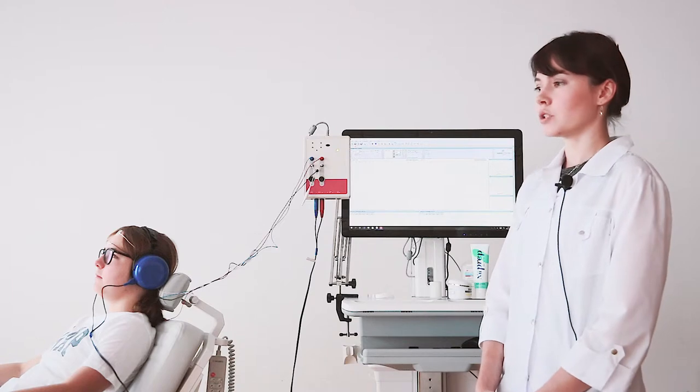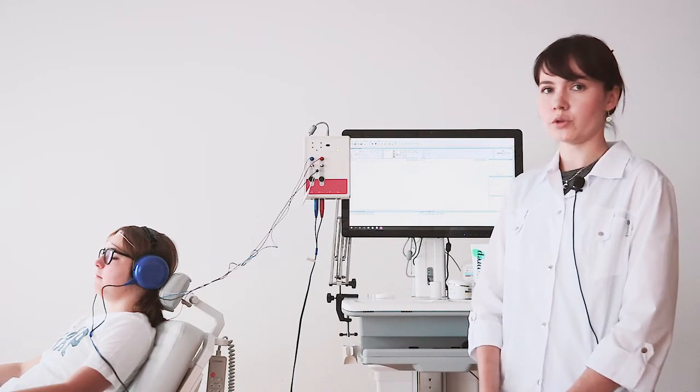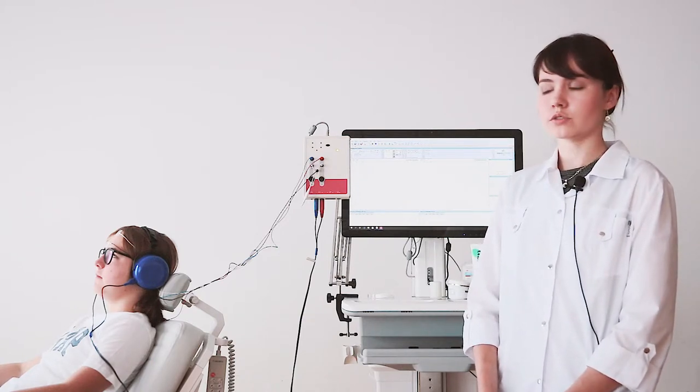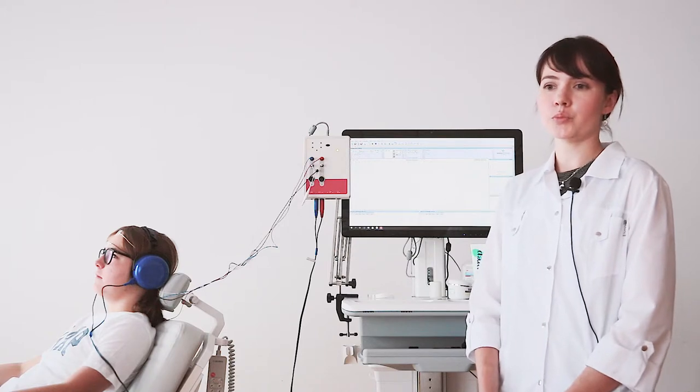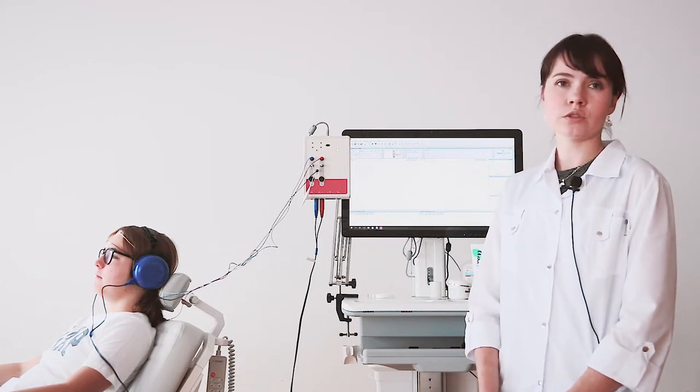And in the mismatch negativity test, you don't need to get the active attention of your patient, so you can evaluate a function of cortex structure in such patients, for example, in coma or in little children, or other types of low-contact or non-contact patients.